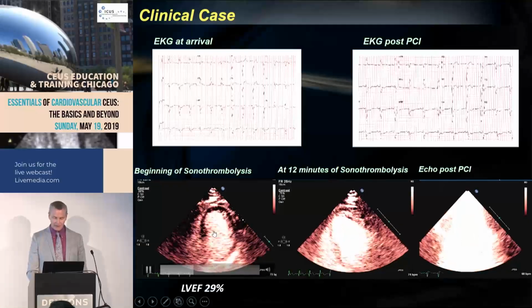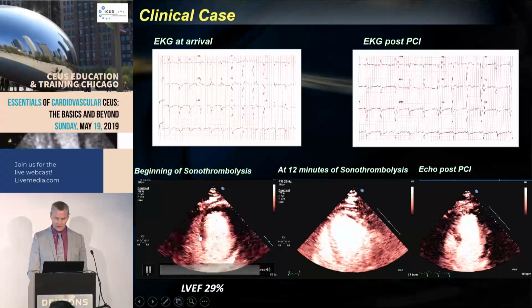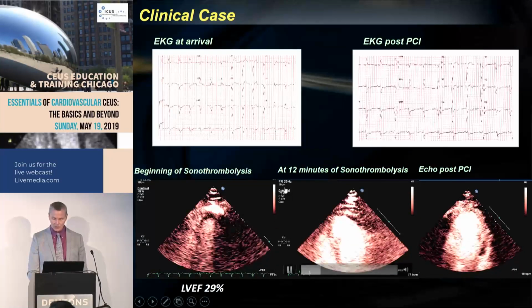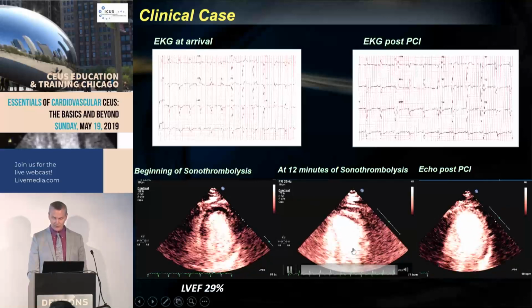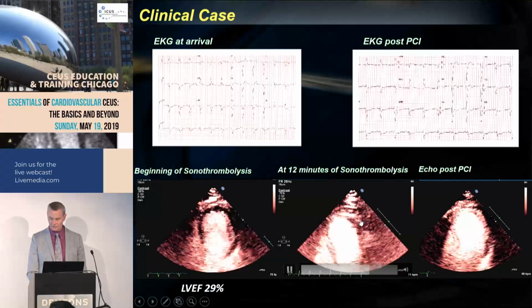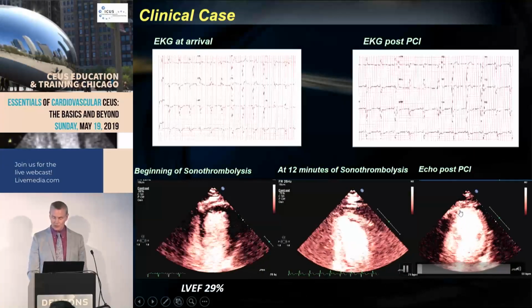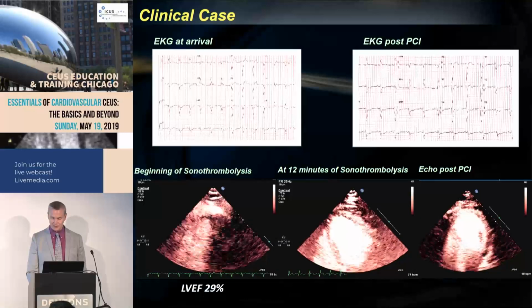And this is what we saw frequently: initially you start out with this huge microvascular obstruction. See it all along here. Look at this territory, similar to images that we just saw in the previous presentation, where you have this huge perfusion defect. Then after 12 minutes, and this particular patient got just 12 minutes of the sonothrombolysis, or the intermittent high MI impulses, you can see already there's a decrease in the perfusion defect. This is after PCI, where a lot of times we still see a residual microvascular perfusion defect if all they got was PCI. Here we can see almost complete resolution of the microvascular perfusion defect. See how rapidly that replenishes in there.